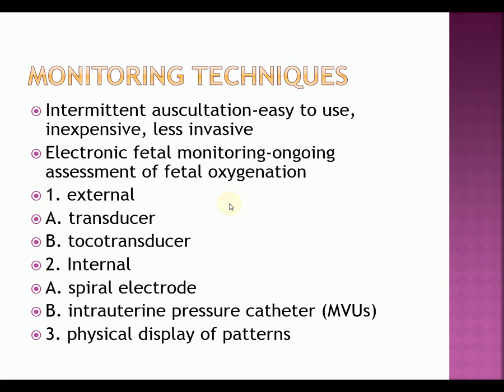Now, intermittent auscultation, since it's hands-on, requires a one-to-one nursing ratio with the patient. It also establishes a good nursing relationship with your patient, so that you're really more helpful to your patient doing a one-on-one with the auscultation.